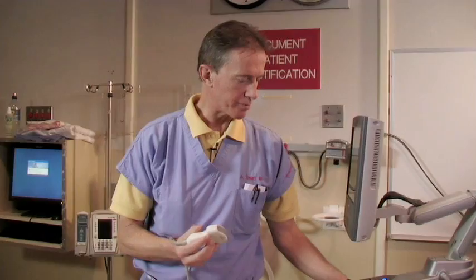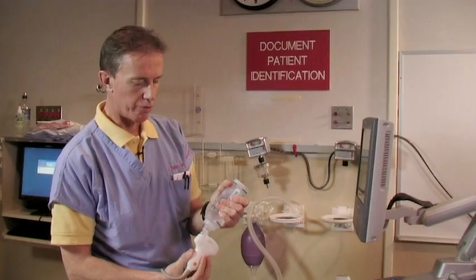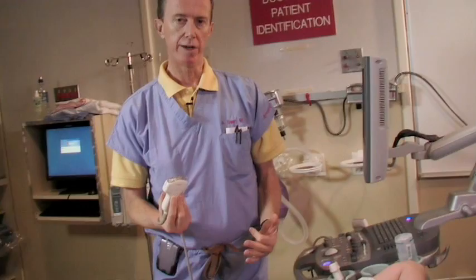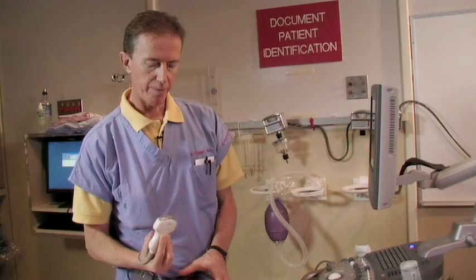Each of these spaces should be checked systematically in real time through all tissue planes to avoid overlooking small volumes of free fluid that have not completely filled the space. I usually like to do it sequentially in the right upper quadrant from top to bottom.